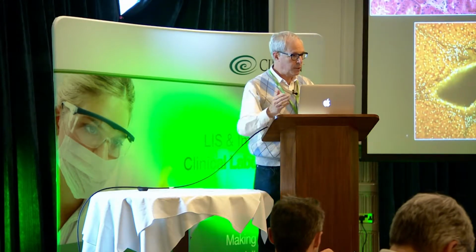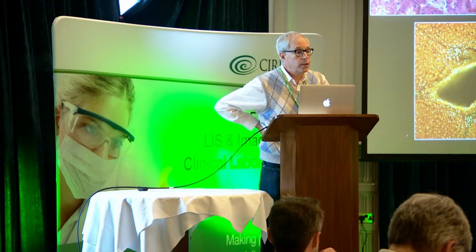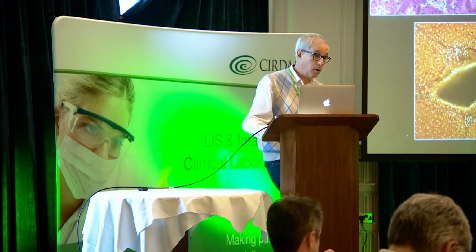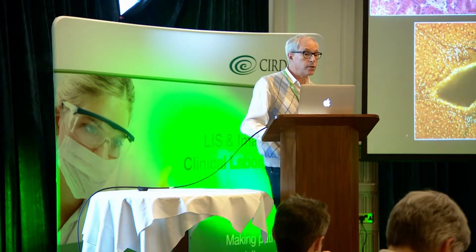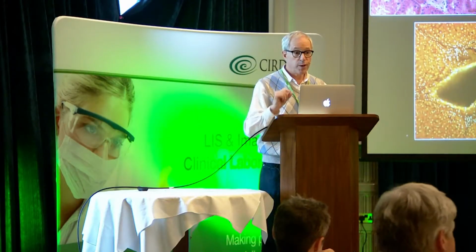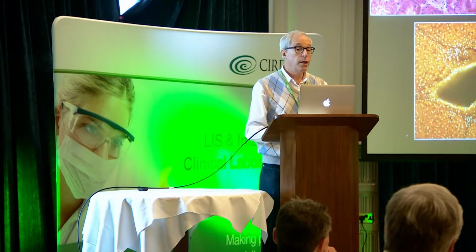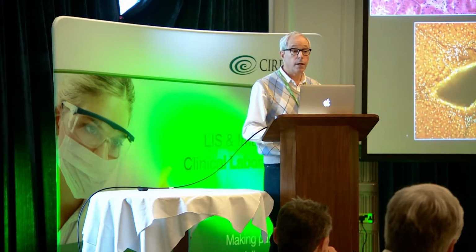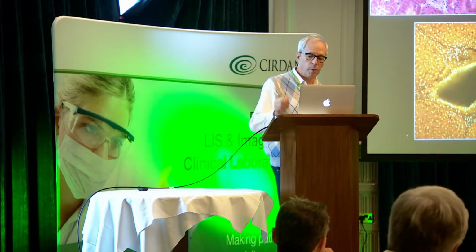And speaking of digging in, why don't we dig in? The talk that I'm about to share with you is not just about MUSE, which some of you have already heard about. It's a new slide-free approach to histology, which has a lot to offer in terms of speed, but also preservation of tiny biopsies. You've heard about that as a problem because it's a way of looking at biopsies without destroying them, so they're all still there for DNA and RNA. And you don't have to be in formalin, so you don't have to worry about formaldehyde problems.